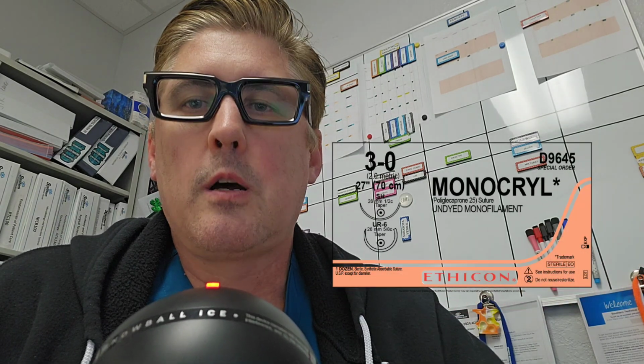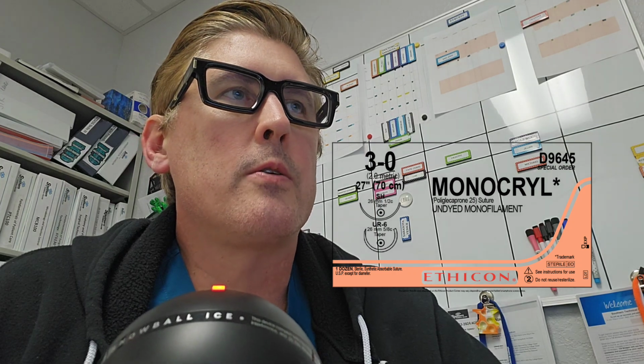Monocryl, and I'll put a picture up of what it looks like, and there are different colors of these. What would you think Monocryl is used for? If you're in the field, you know it's probably for closure. It is for closure, right? It's a monofilament suture, which means it's one strand of suture. It's used for skin, cosmetic surgery, soft tissue, right? Available in undyed, clear, or violet.